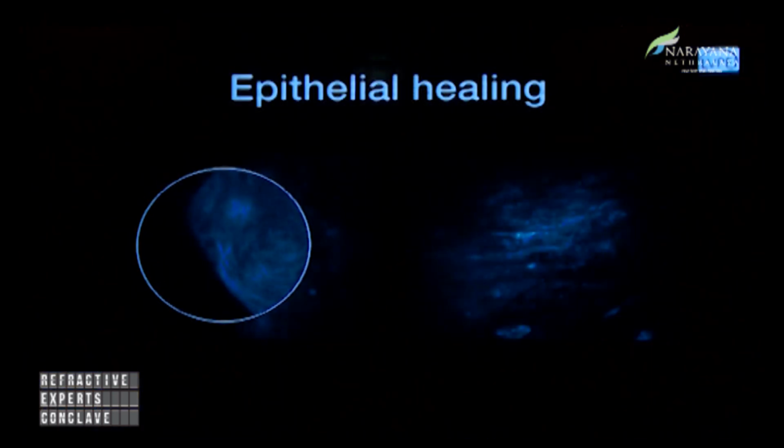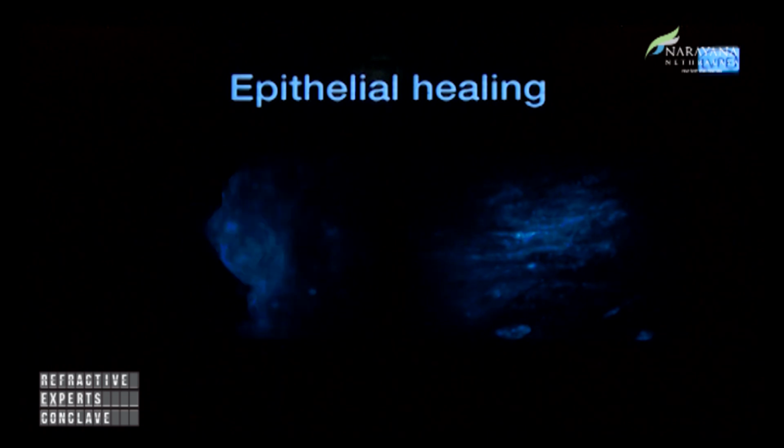Now these are some interesting confocal pictures. The one on the left side shows you what epithelium does. It actually is like a slide. A large portion of the epithelium separates and starts to move centrally to cover the defect. The picture on the right side actually shows the elongated pseudopodia of the epithelium as it moves across. I just thought that was interesting.